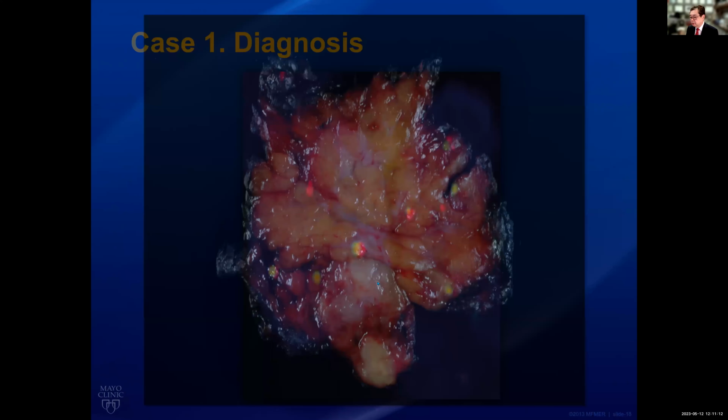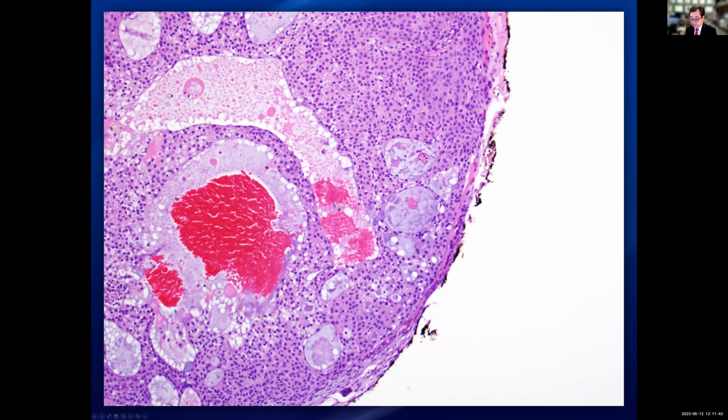With the previous case, we were pretty confident this is mucoepidermal carcinoma, with most areas showing more of the epidermoid component, a little bit more solid than the previous specimen a year ago. At higher power we see mucocytes here and here. Very nice mucocytes. However, the margin is positive, right?